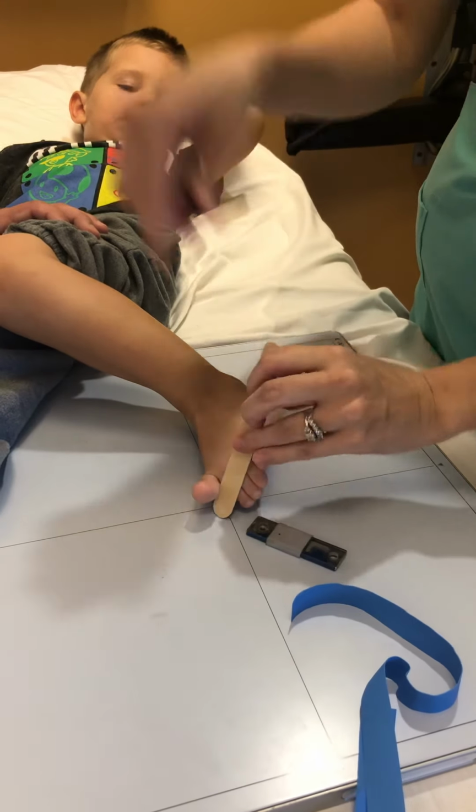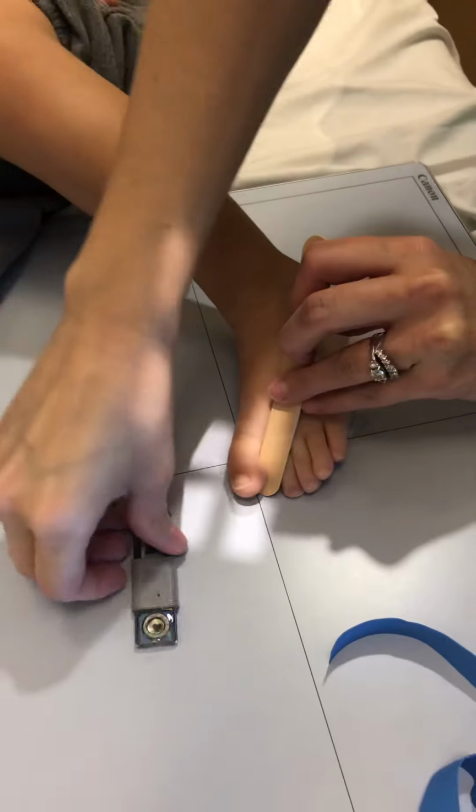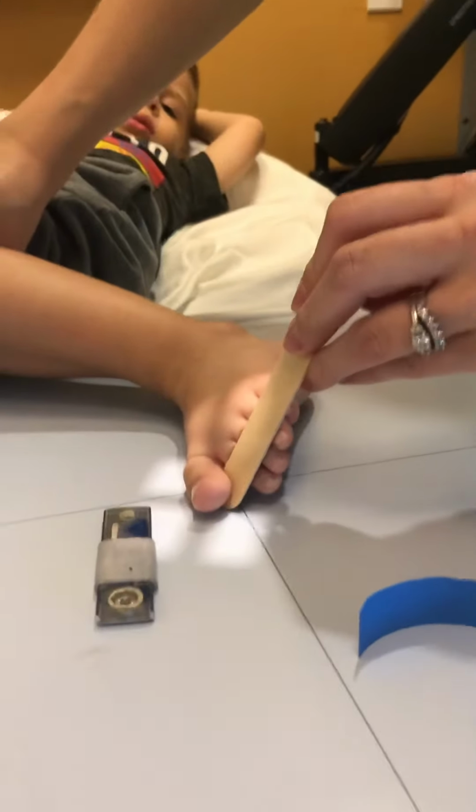Okay. Just relax. So I'm going to try and just get this all set up, and then we're going to do it just like that. Okay. So something like so to separate the toe itself.